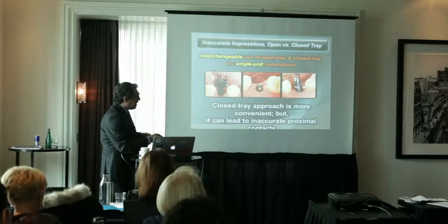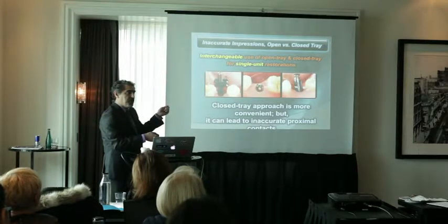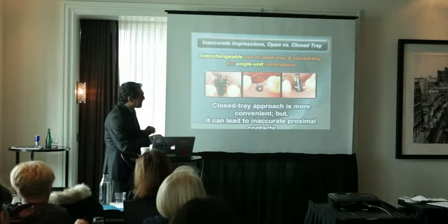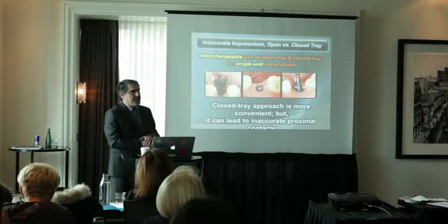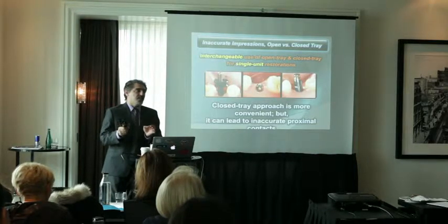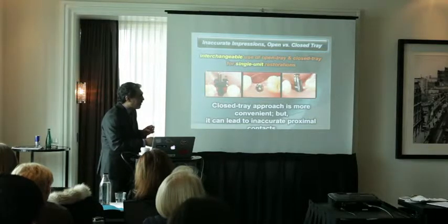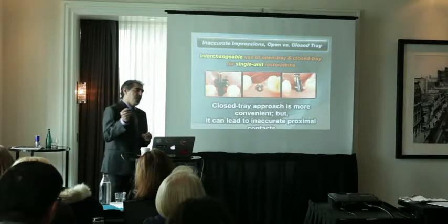While when you are taking the impression, let's say that, for example, in this case, the head of the impression transfer is here, okay? When you take the impression and you want to put back the transfer, you will see that you have only this much space from here to here, and this much of the transfer will go inside the implant, and that will cause an unstable condition for our transfer. So for any case where you can't have a long enough closed tray transfer, I would say that it's better to go for open tray.